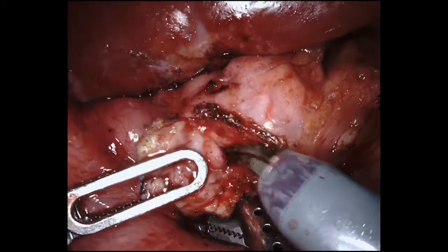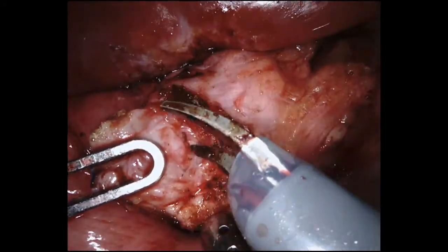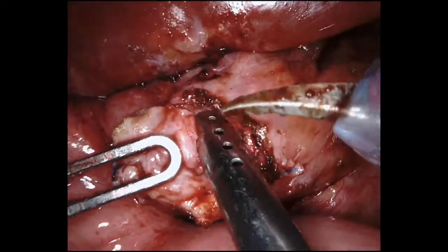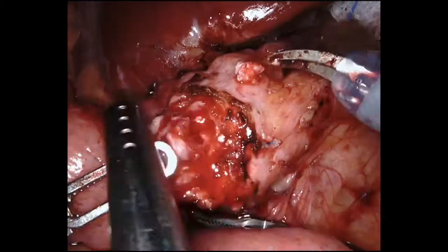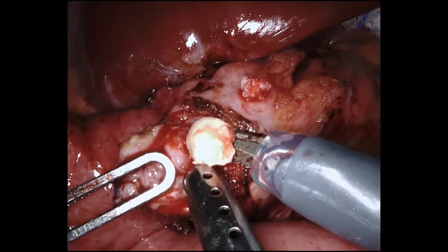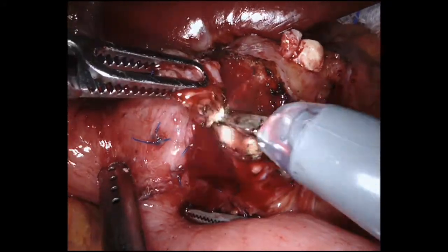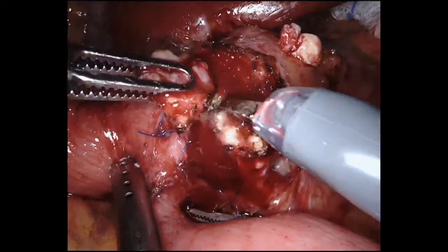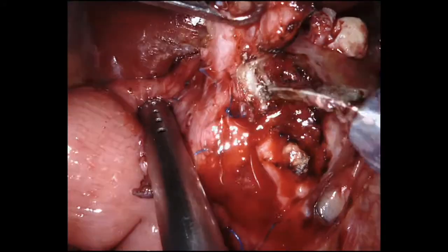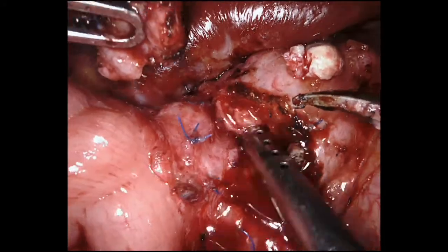The dilated main pancreatic duct is found during division of the pancreas. Small stones are found and removed from the pancreatic duct. Removal of the pancreatic tissue is completed, maintaining the posterior layer intact and the pancreas partially attached to the jejunum.